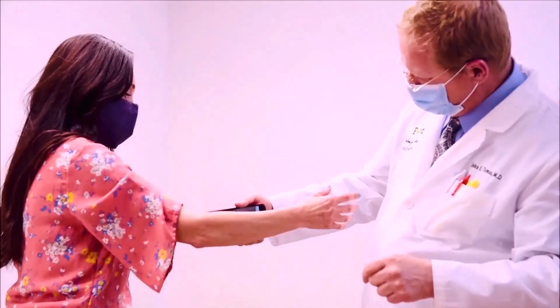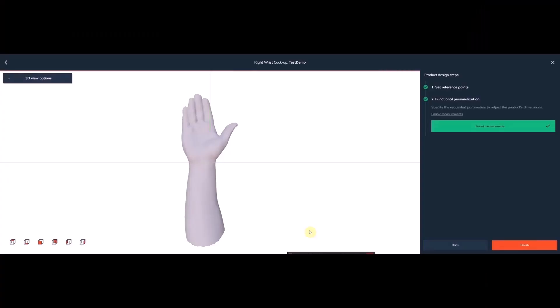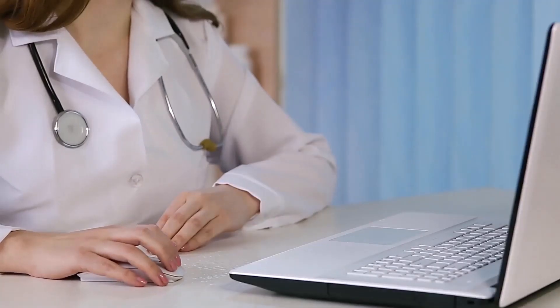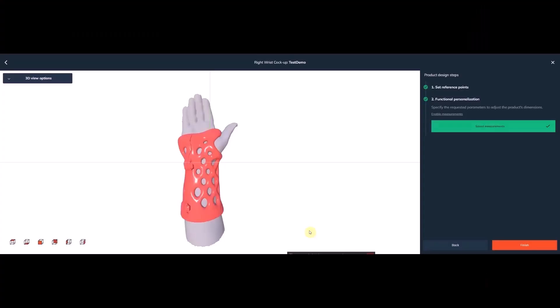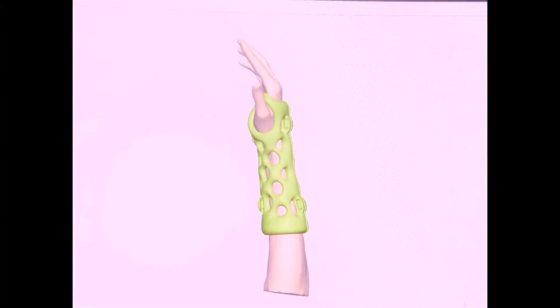Our digital system includes a free iPhone 3D scanning app that creates a full color model of the limb. Our cloud-based design software is simple to use, giving you and your staff the ability to create fully custom designs unique to each patient in minutes.